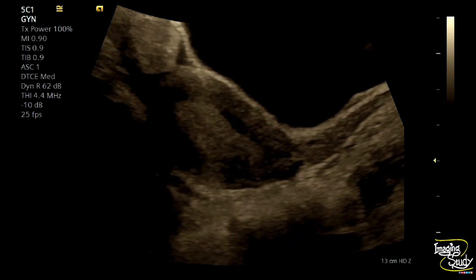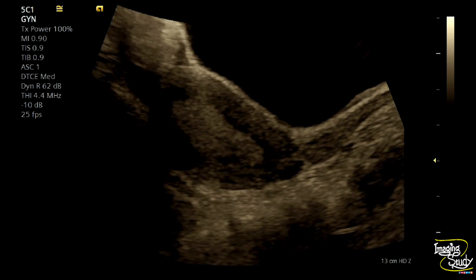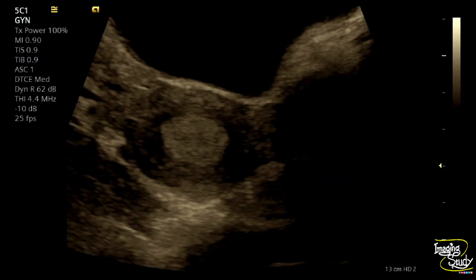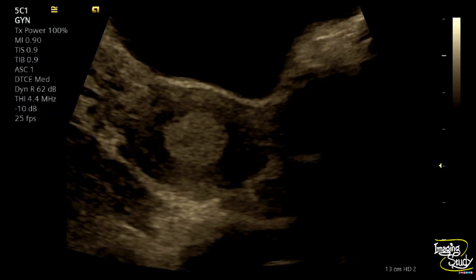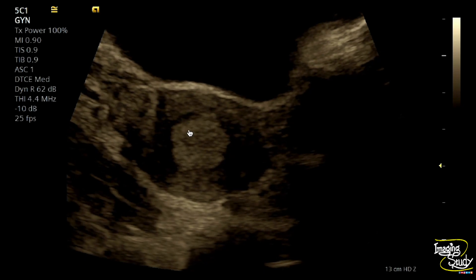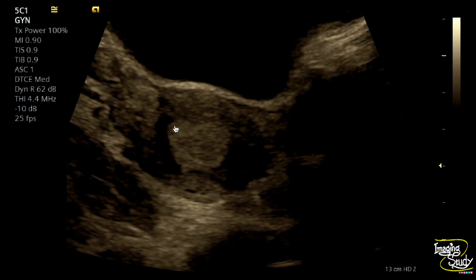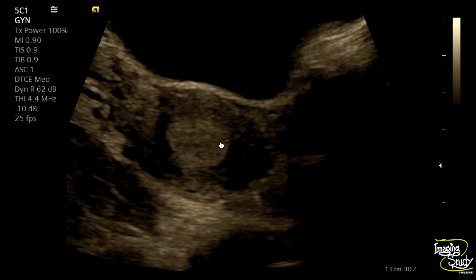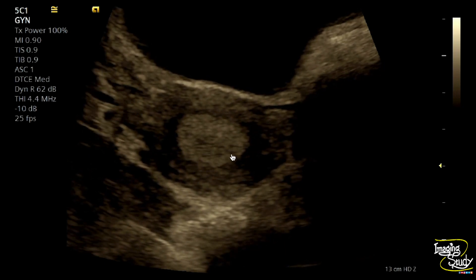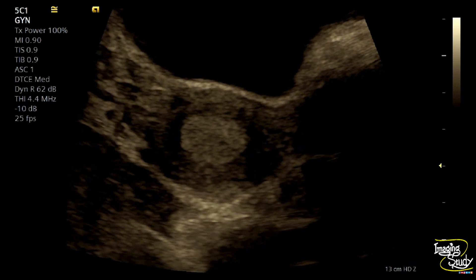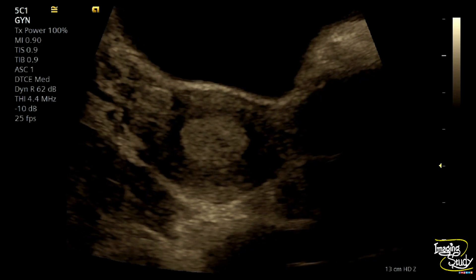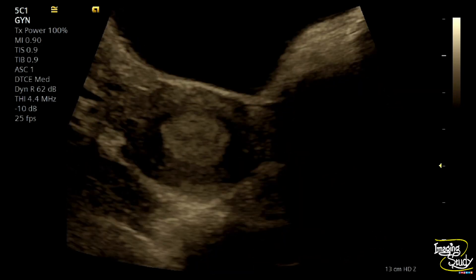Let's check on the transverse section, which may help understand quite well. Here is the transverse section. If you look at the endometrium, you can definitely appreciate there is motility within the endometrium. This is not a retained product — this is a 12-year-old girl with no history of menarche. Hopefully the menstruation will start soon. So this is a case of endometrial waves.